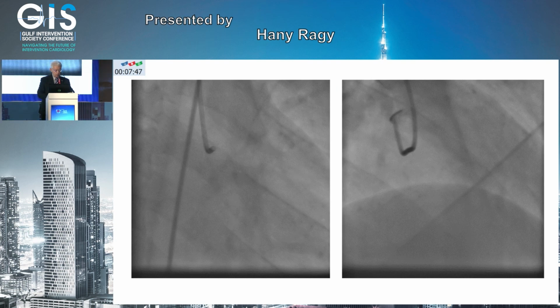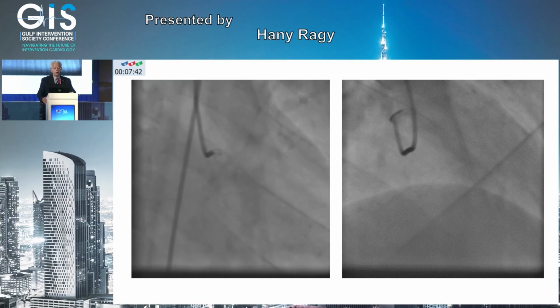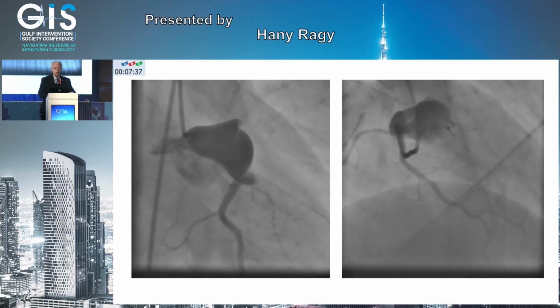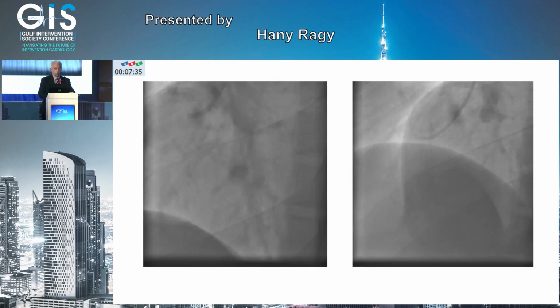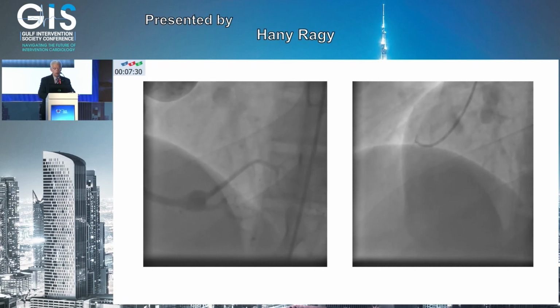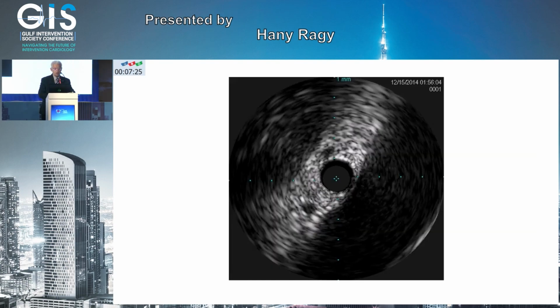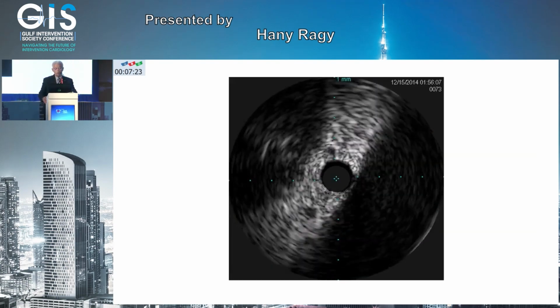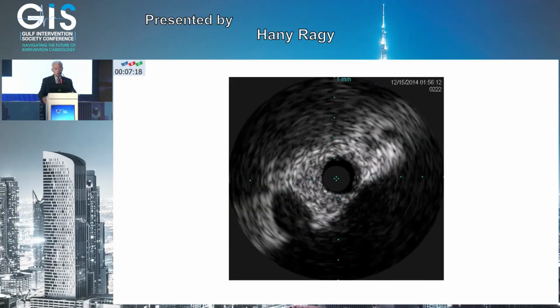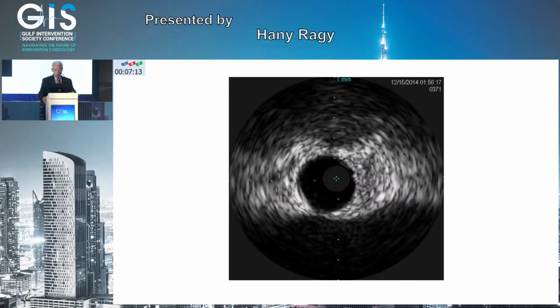This is a young man who had this aneurysm. When you see this, there's actually very little that you can do. This patient had flow restored in his LAD and was sent for a LIMA. He's young, he's 29, and this is his IVUS. It's a bit on the longer side, but you can imagine there's no atherosclerosis, and you'll see the huge aneurysm and the thrombus.